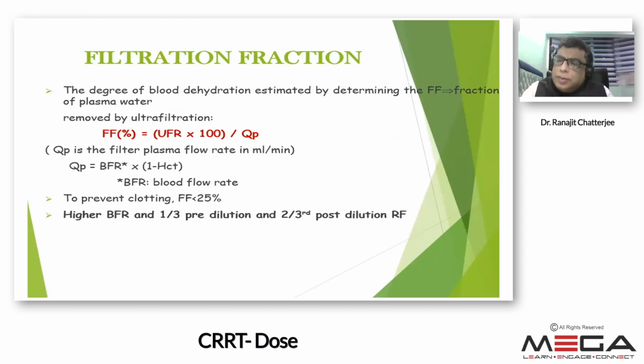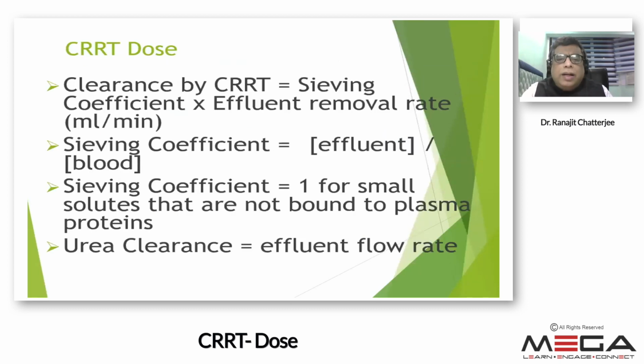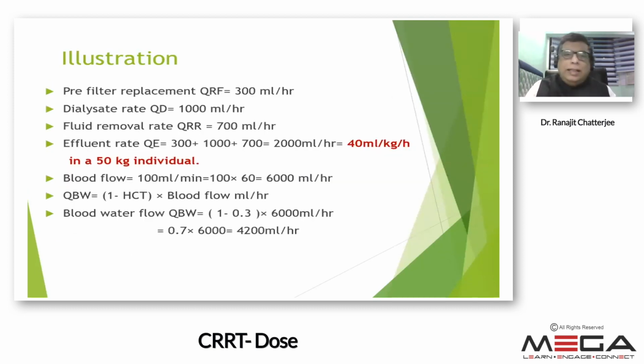Filtration fraction has been explained by Dr. Vivek. I'm not going into the details of this. Sieving coefficient has been told by him. Now let us see this illustration.